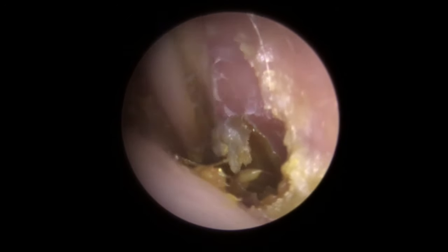You can see we've managed to get a good grip now on this last section of wax here, so it's just working its way out of the canal. There we go — you can see it's on its way, still coming out of the canal. So quite a long piece of wax, this one. I'm going to bend it around to the right-hand side now just to be able to manoeuvre this out. Still coming — still going. I have slowed the video down, but yeah, and there we go — and it's just coming to the end of it now. Took away that little bit of dry skin on the outside part of the ear canal. And there we go — you can see just how long that plug was.